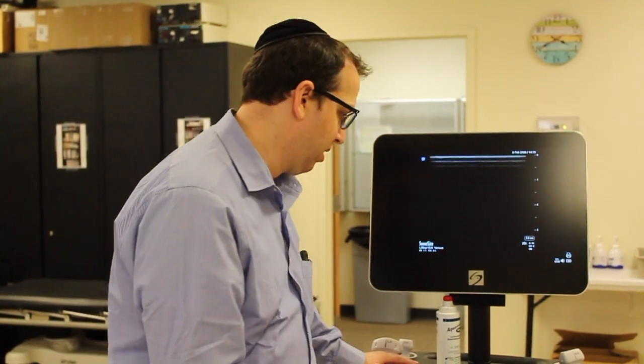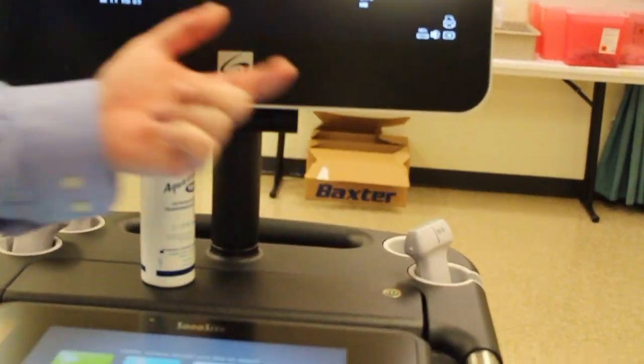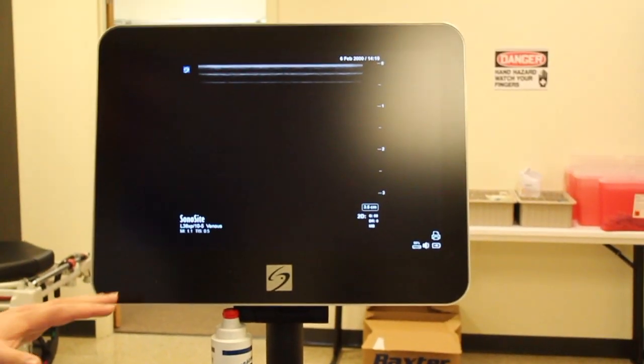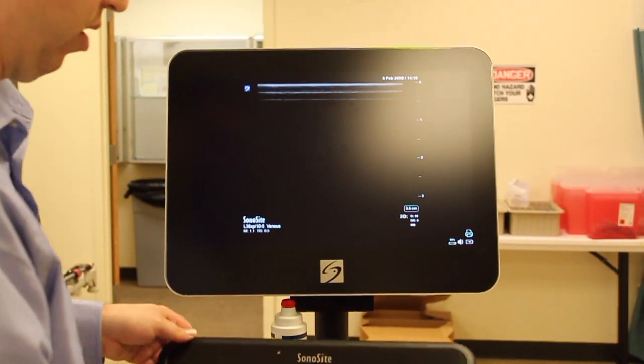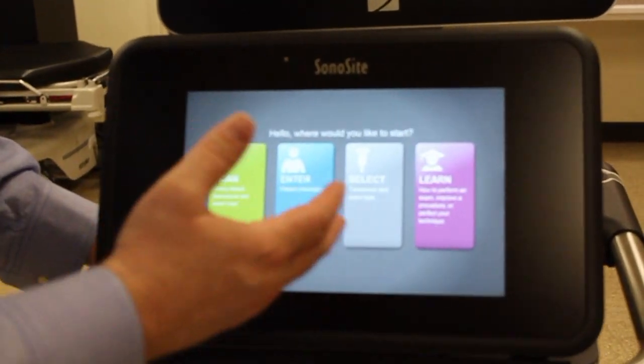First things first, you're going to want to make sure the machine is plugged in, and then you're going to power it up. It's already powered up, but there's a power switch here. The upper screen is going to be the display of the actual ultrasound, and the bottom screen, which actually flips up, is your touch screen and your menu — how you interact with and manipulate the machine.